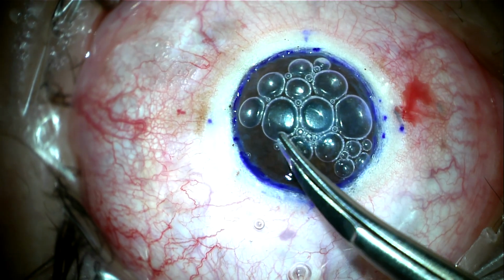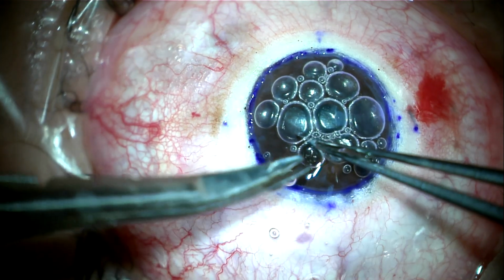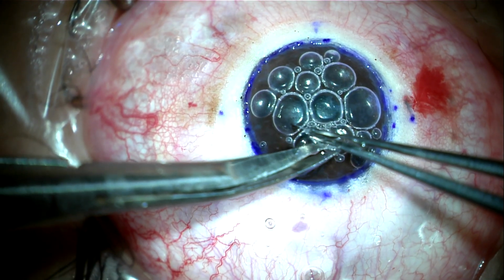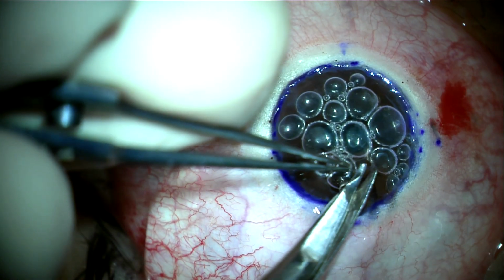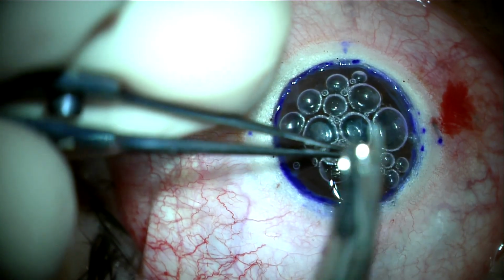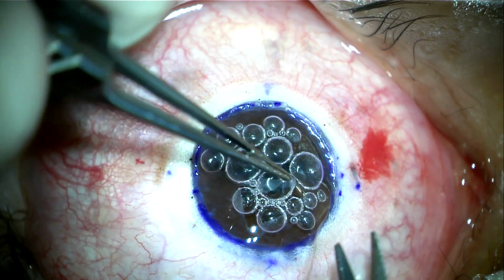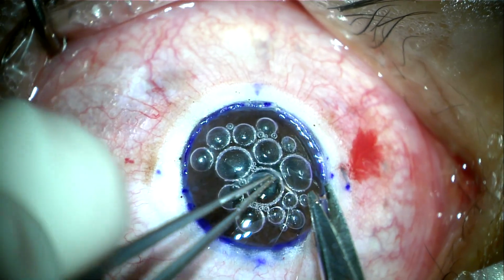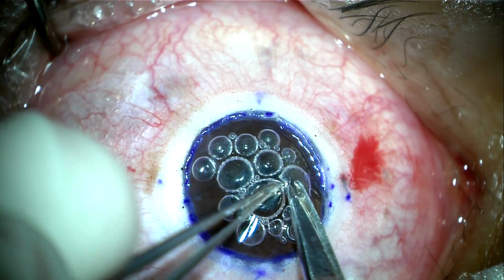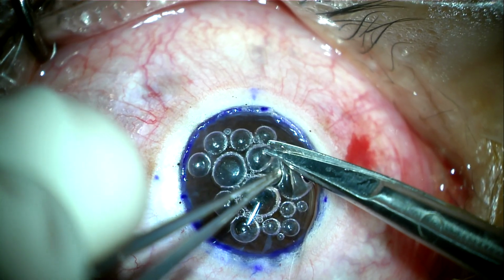Baring of the central part of Descemet membrane is done by careful removal of the stroma. It is to be noted that the stroma should be grasped by a fine-toothed forceps and pulled gently away from Descemet membrane. The scissors should cut the stroma without any contact or pressure over Descemet membrane. Cutting should also be done in small snips to avoid rupture of the fragile Descemet membrane.